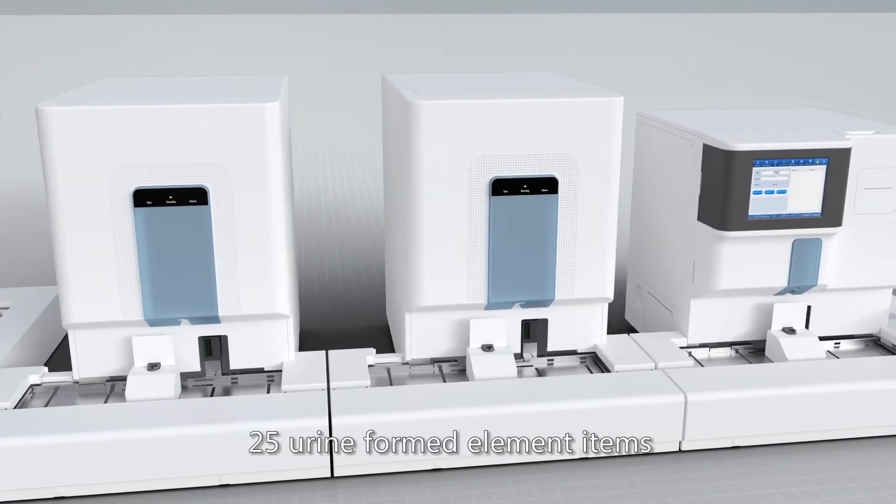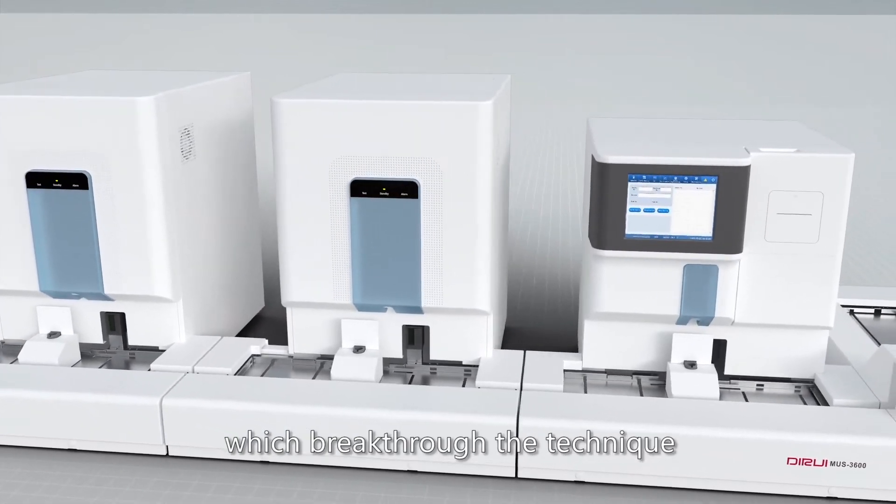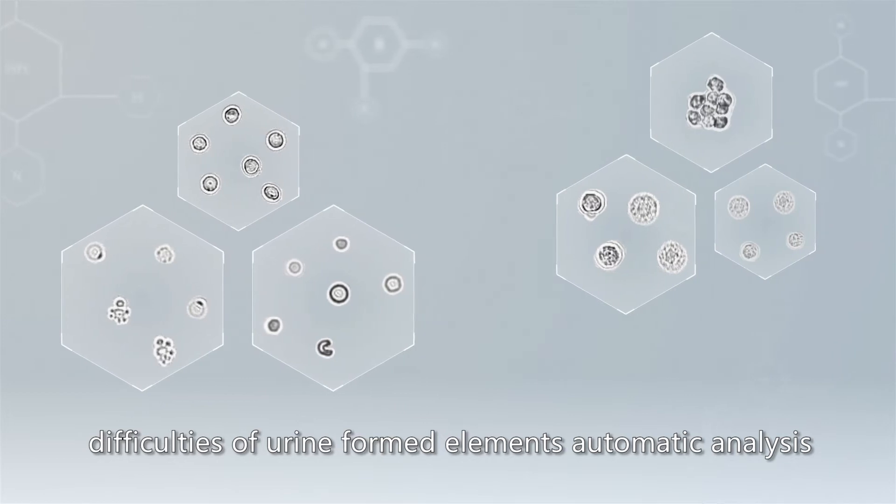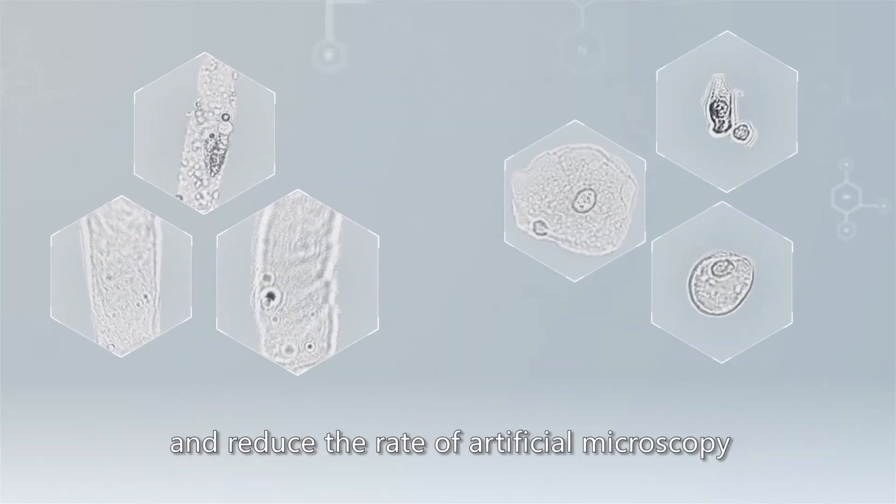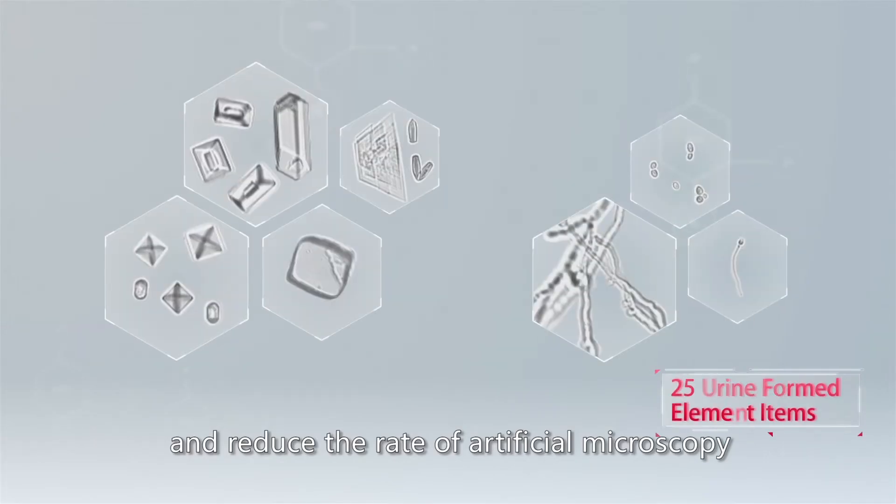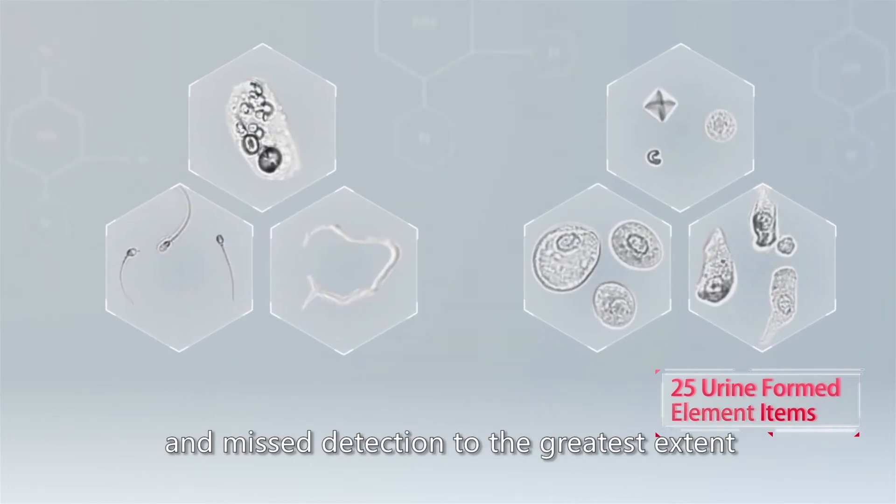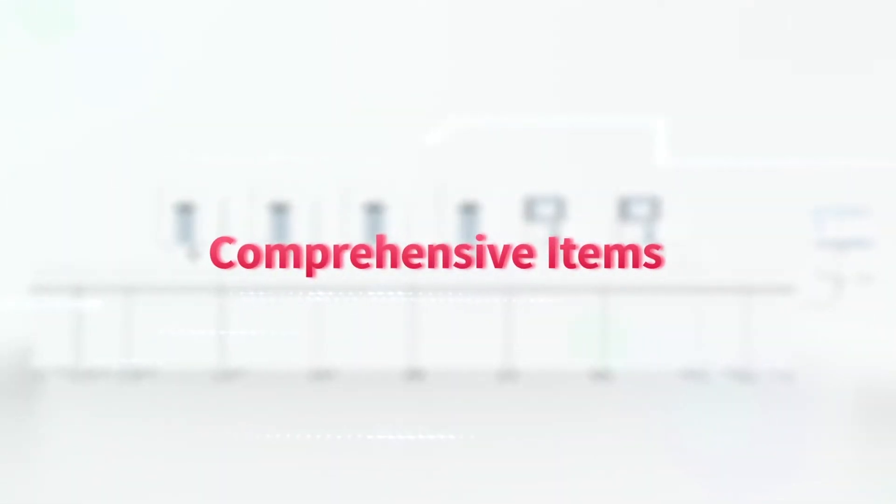25 urine-formed element items break through the technical difficulties of urine-formed elements' automatic analysis and reduce the rate of artificial microscopy and misdetection to the greatest extent.